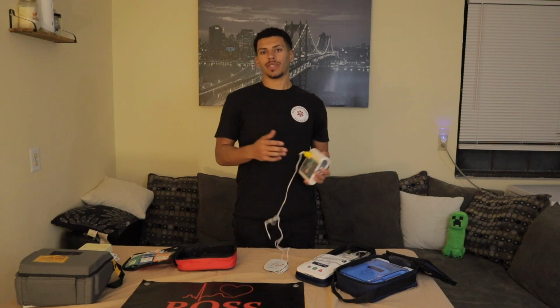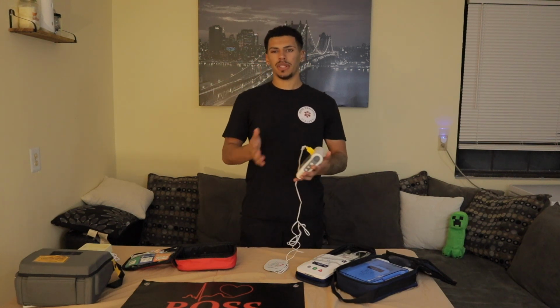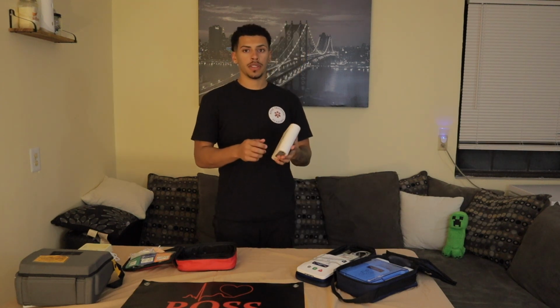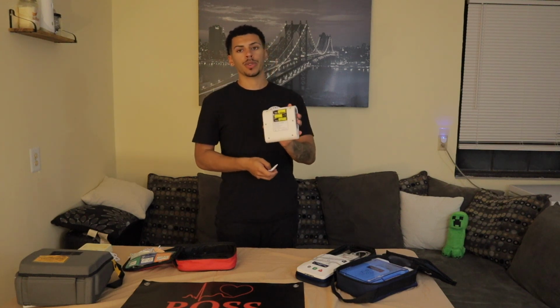So the scenarios are all just different. So basically, shock, no shock, shock, shock, shock, shock. And that'll just kind of be like the different types of scenarios. The batteries this thing uses are on the back side. You slide that open, and it takes 3 AA batteries, and that's how you run this.